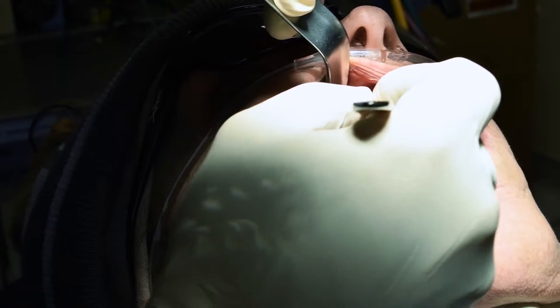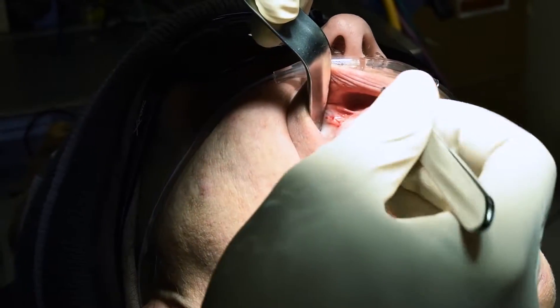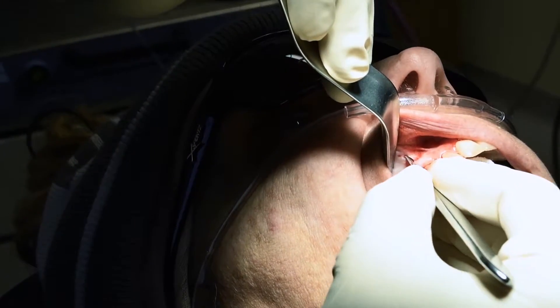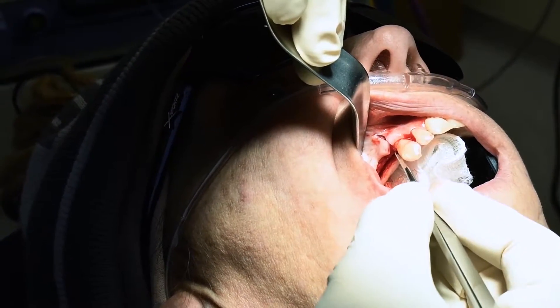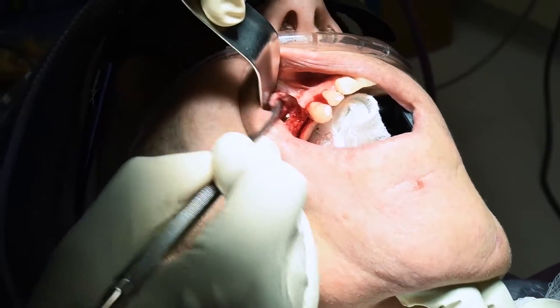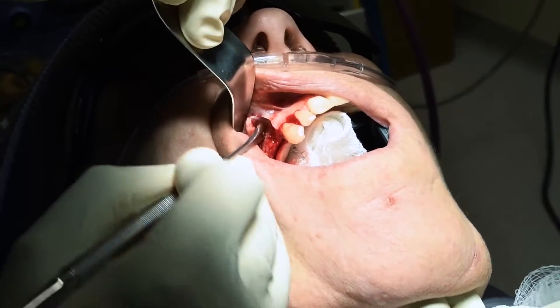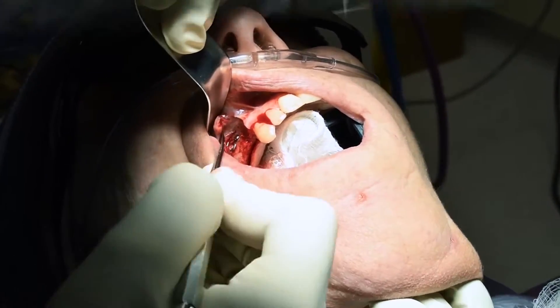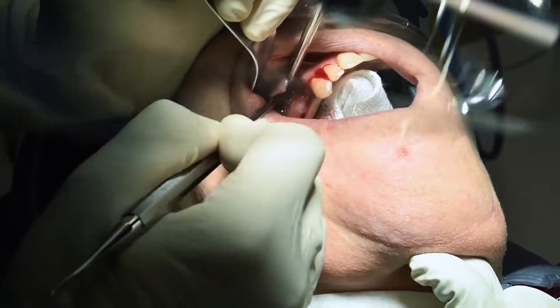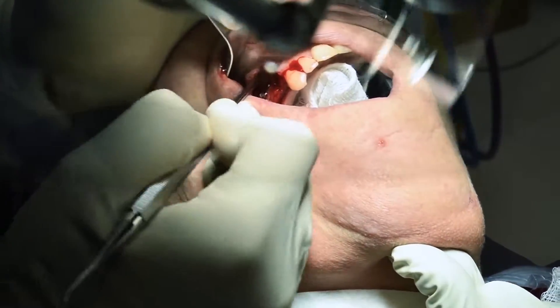I'm going to actually go a little bit farther forward there. I need this little vertical release to be able to adequately reflect this tissue so that I can see the plate and then be able to remove that plate. So you can see there's the anterior aspect of the plate.